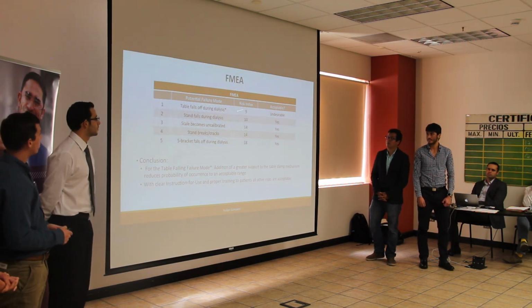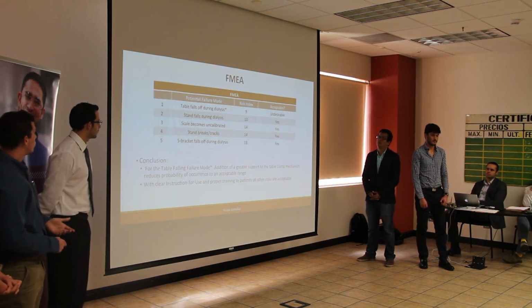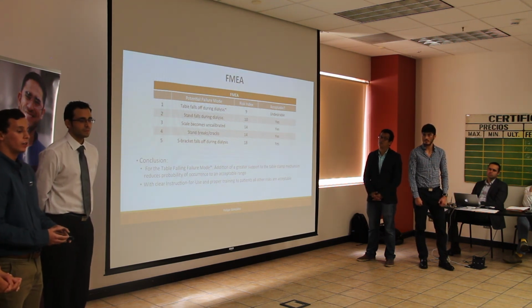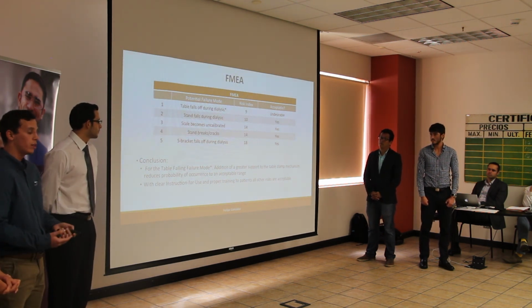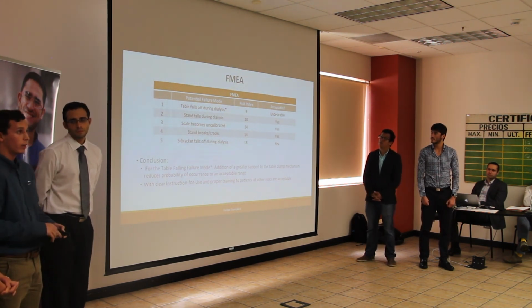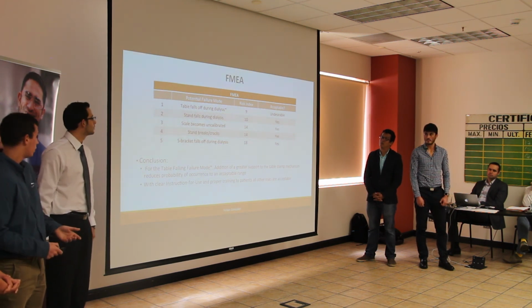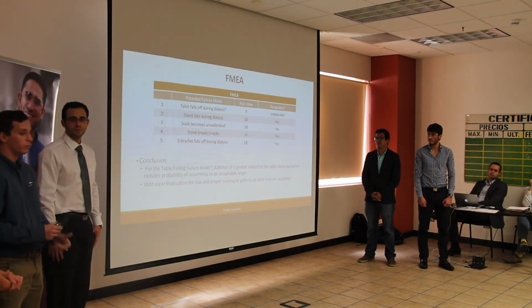The other problems, because they are above 9 in our risk index, are acceptable in accordance with our design. Our mitigation for the table falling during the treatment would be to add greater support to the table clamp mechanism so that it will hold the table and lower the occurrence rate. Also, every patient that undergoes peritoneal dialysis has to undergo training so they can have the treatment at home, so we think that including that device during the treatment will be helpful for the patients. And with clear instructions for use and proper training, all other risks are acceptable.